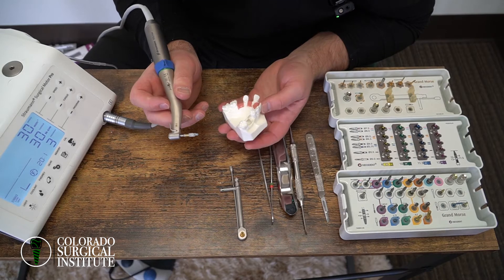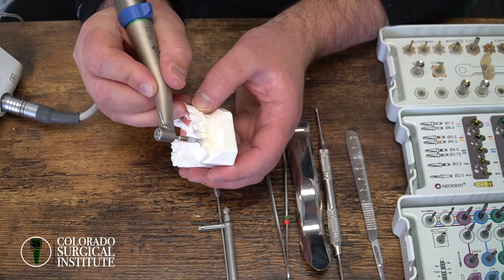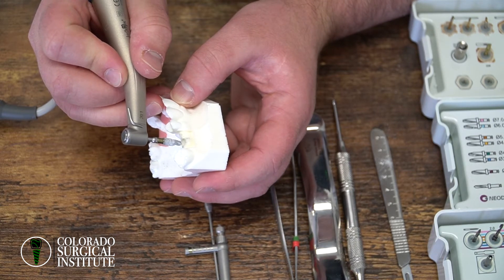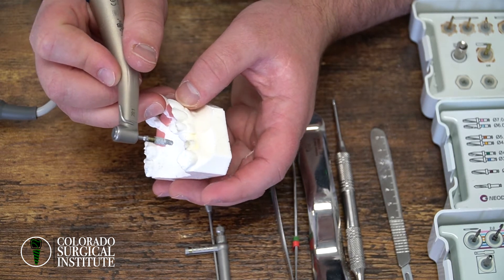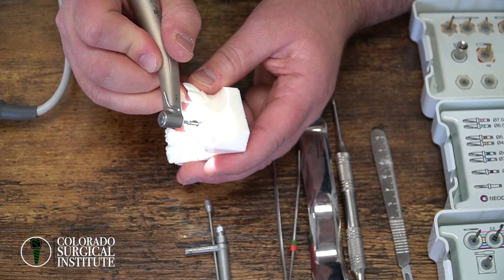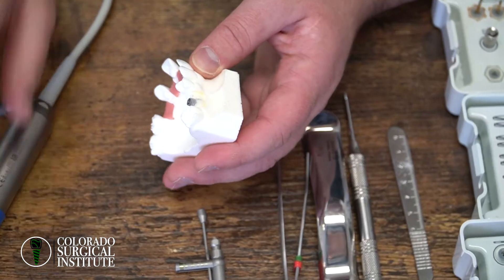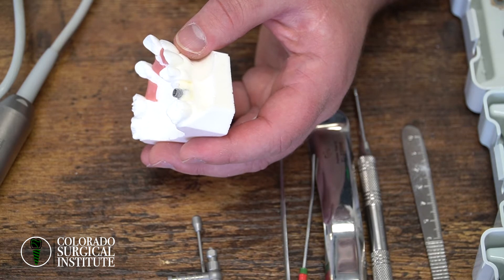Let's talk about a few situational things. First, we're going to talk about if you're placing an implant and it stops too high in the osteotomy. So let's say you're putting an implant in and it stops like four or five millimeters above where it should be. At that point, your options are: you take the implant out and you drill more.